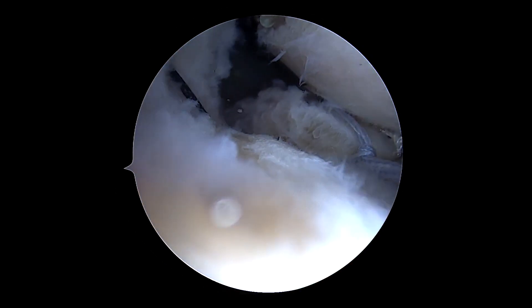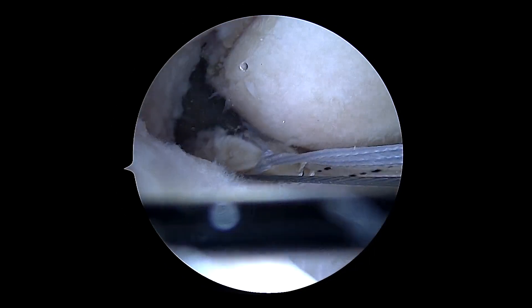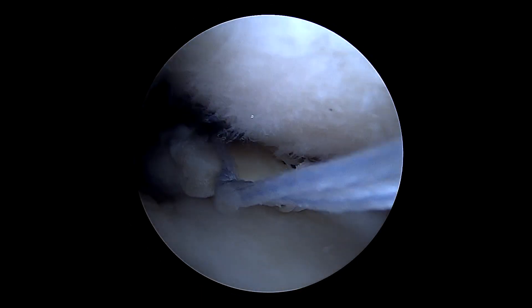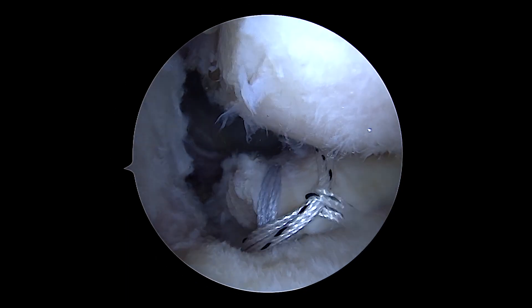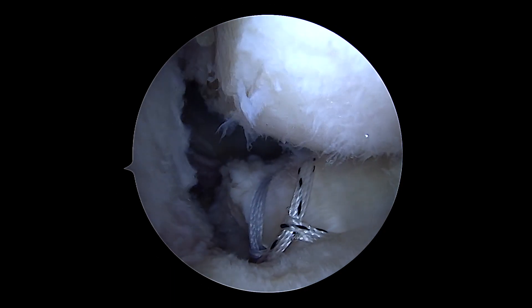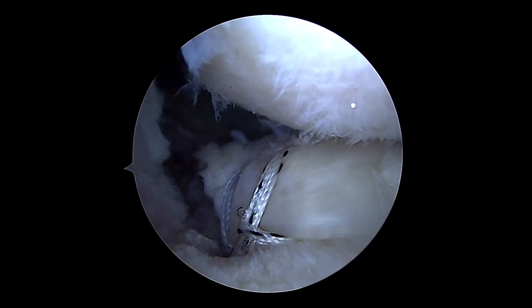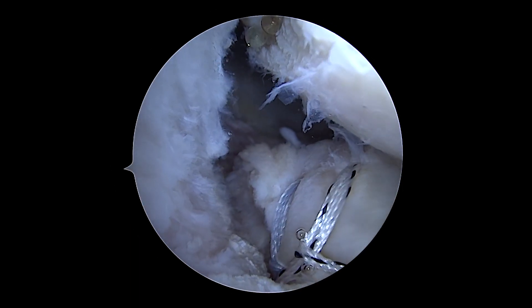Typically if the meniscus quality is good we'll pass two of these sutures. Now we have our FiberTape link in as our second stitch — placing it a little bit more on the inside, really wanting a good span between the two with good visualization. We've captured some good tissue there. With both sutures in, we have really good control of that posterior root. We grab our wire shuttle that we had parked in our lateral portal through our passport and shuttle transtibially into our socket. We pull those on through and can directly visualize our tensioning — with just two sutures you can see really great tensioning and a nice anatomic repair back to where we wanted it.